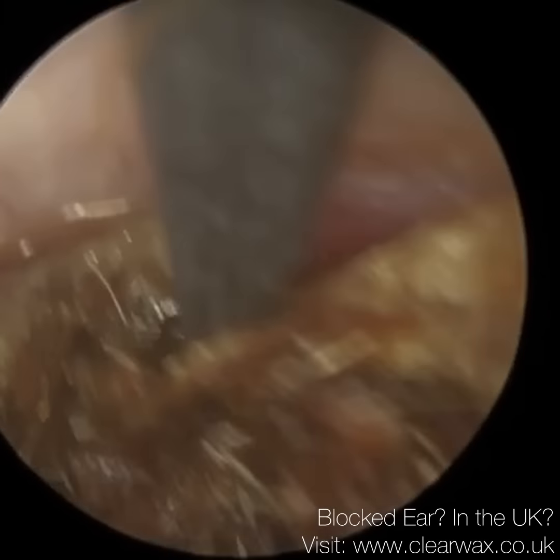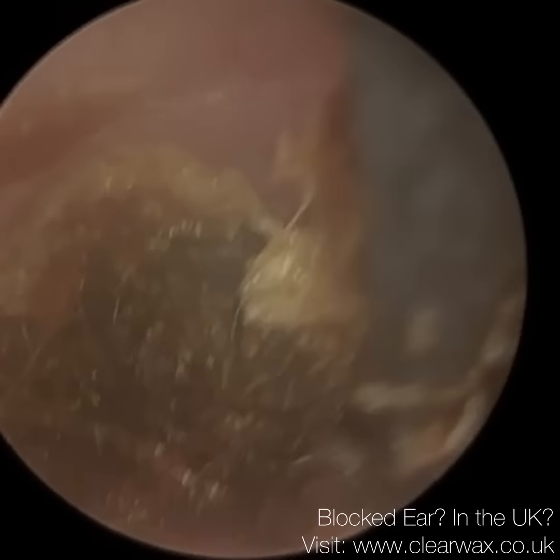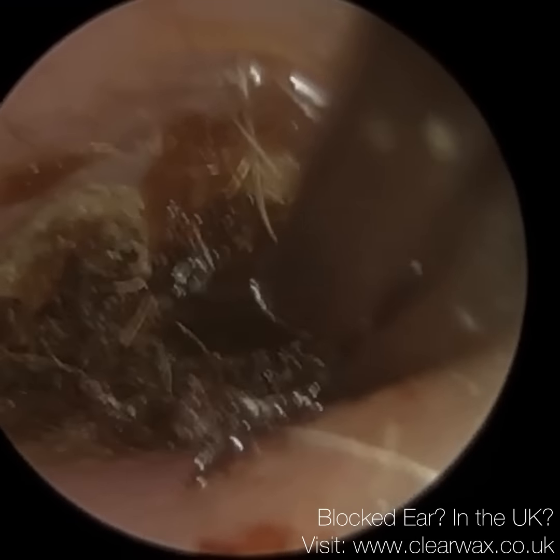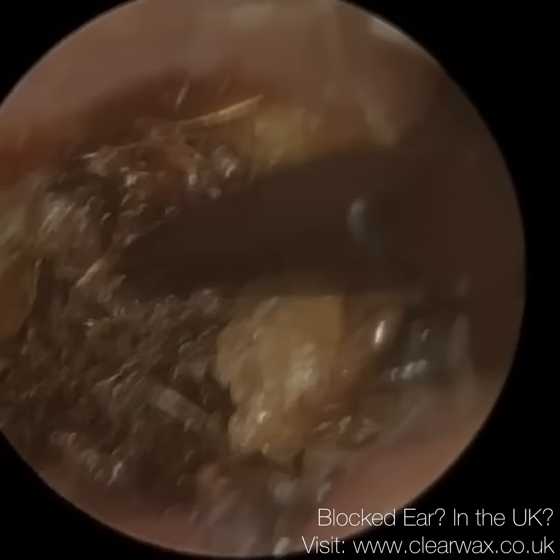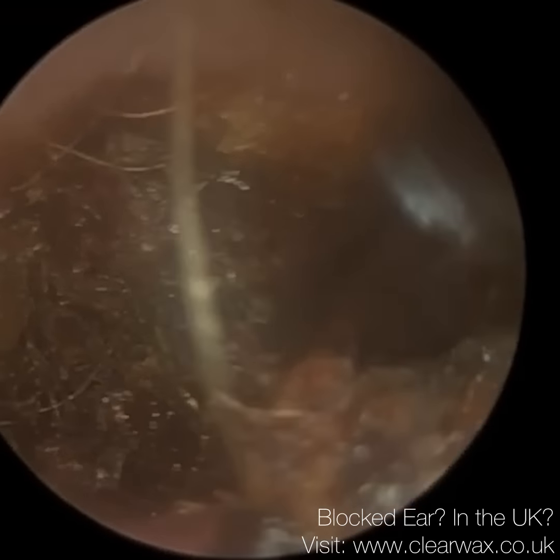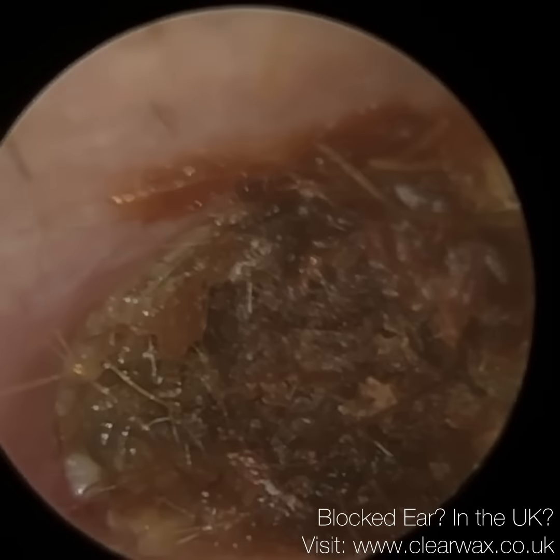I'm using the ear pick to separate the back of this plug from the canal wall, and it just has this tendency of bouncing back. So it has a lot of kinetic energy, and that's because the skin is, as mentioned, interlocked, all the individual skin cells, and then it coils over itself. So it has this springy texture. So I'm just using the forceps. I've used the ear hook just to try to separate the back part of the plug.